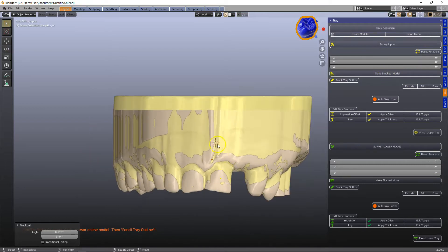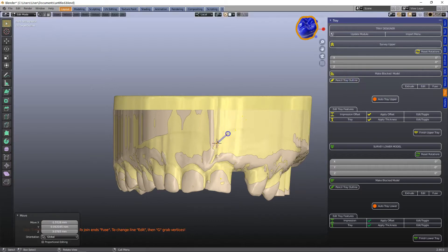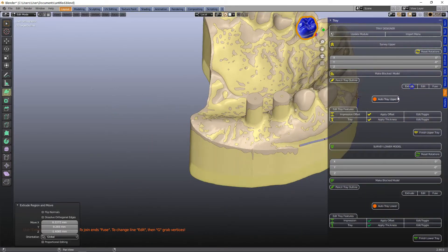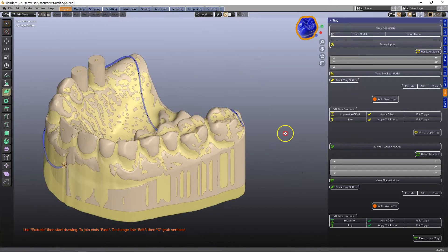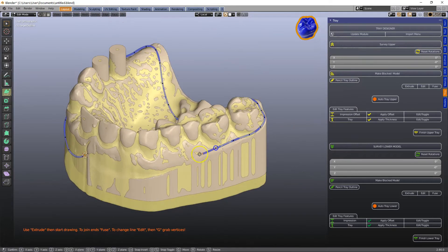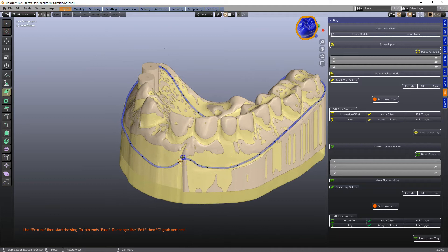Then we're going to use pencil tray outline and then E to extrude and G to grab or click on the extrude and then left click all the way down to the end and then F to fuse.